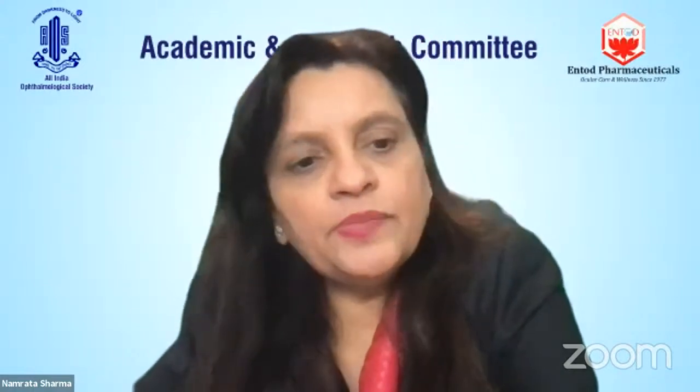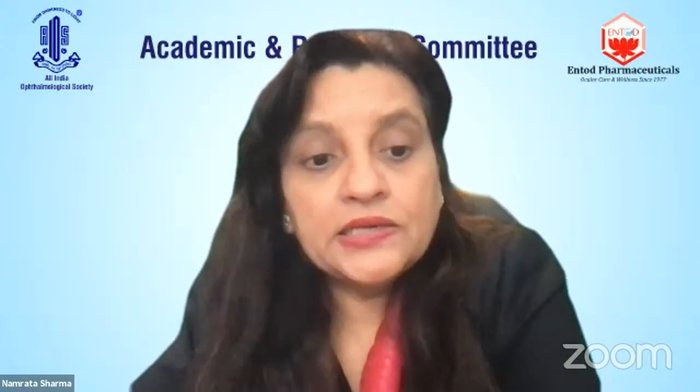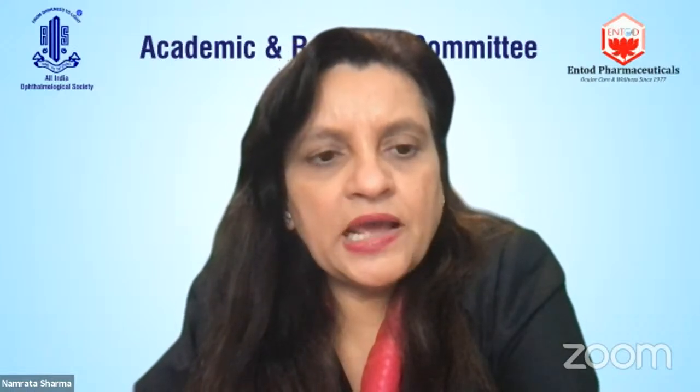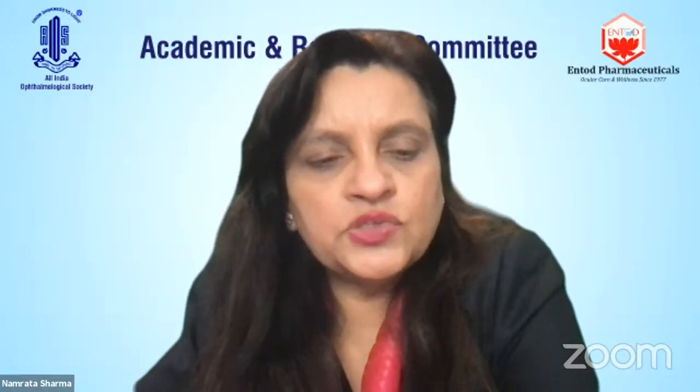I remember Dr. Vasavada's paper, where in the initial paper he had said don't capture because it will cause a lot more uveitis. But in the subsequent publications, he said that with the newer lenses and the newer variety of haptics and optics now available, we should always capture in the posterior capsular rexis. What is the size of the posterior capsular rexis, Karan? It would be approximately 3.4 mm. It shouldn't be too large because the IOL will not be stable.